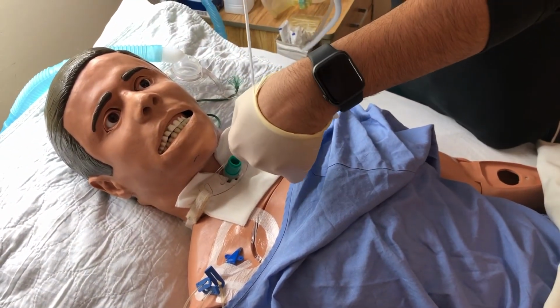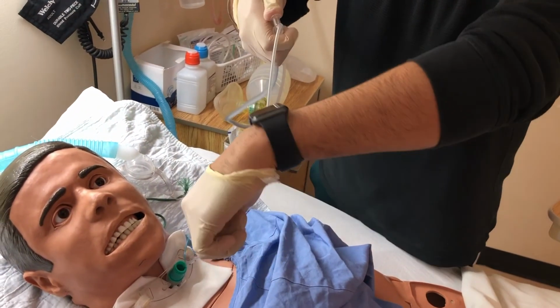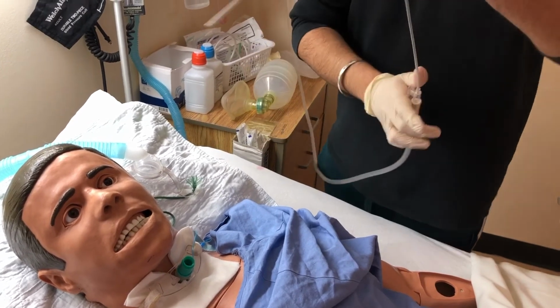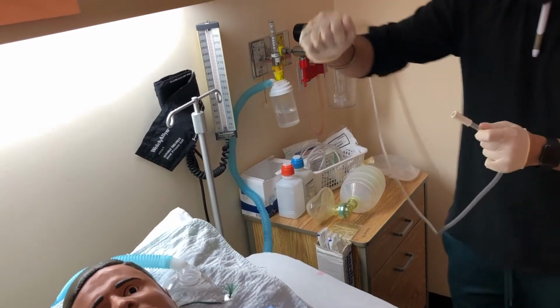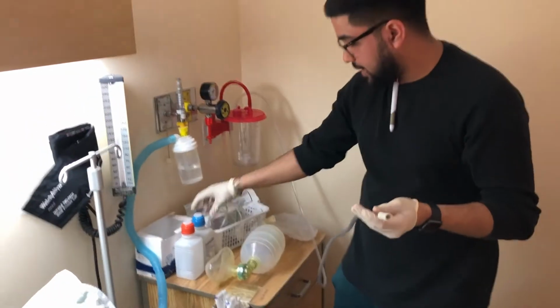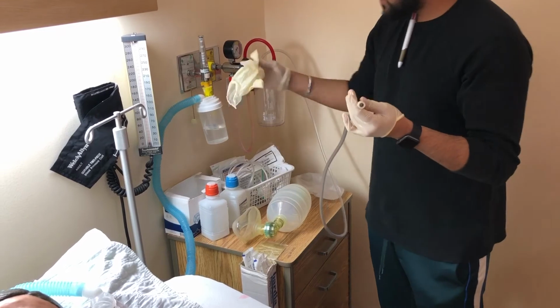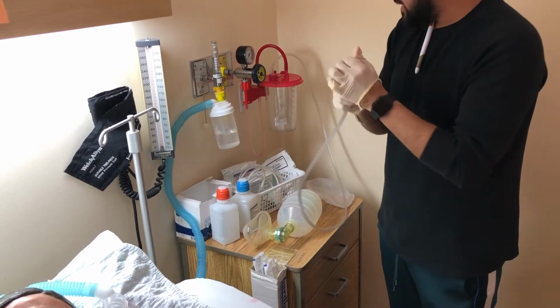There we go. And as I come out, I can do something called intermittent suctioning, which I would click here and it would suction, and I can spin this like that, and we would do as such. We can grab this with this hand and discard of this catheter, and the suctioning is now done. What we could do with this is get our sterile water, which is right here, and suction that, as well as put a glove over top to show that we are done suctioning and to maintain cleanliness here.